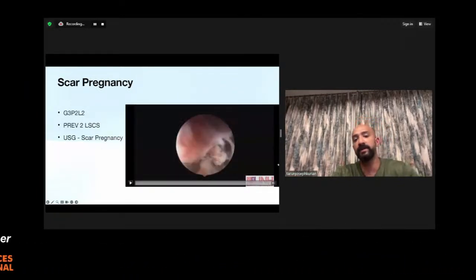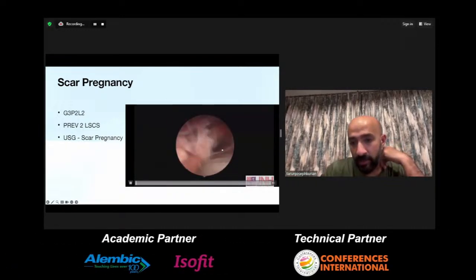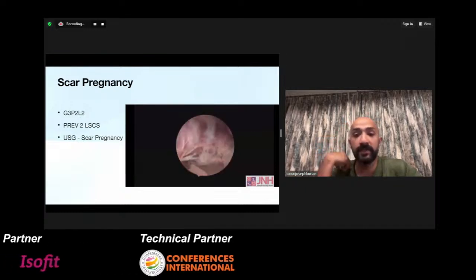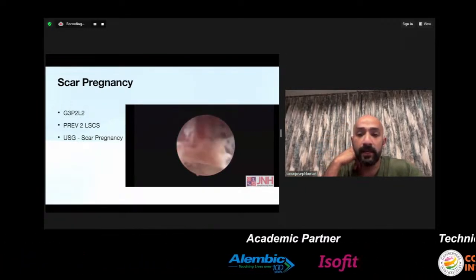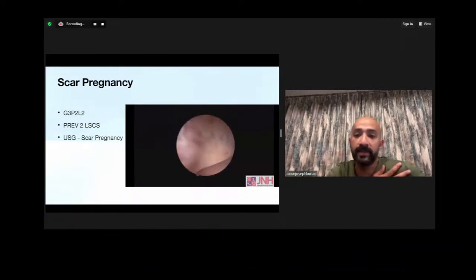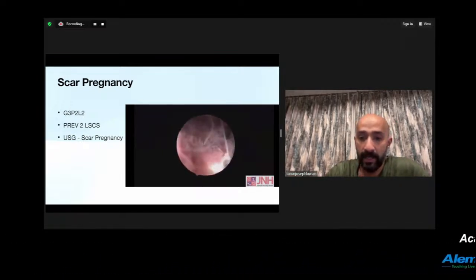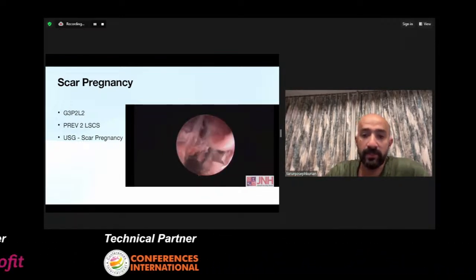The next case was a case of a scar pregnancy. I think Nayanaka already showed us a fantastic video of a scar pregnancy. But this is another one. So this is the hysteroscopic view. You can see the decidua thickened over there, sticking into the uterine cavity. So this is the picture that we can see.